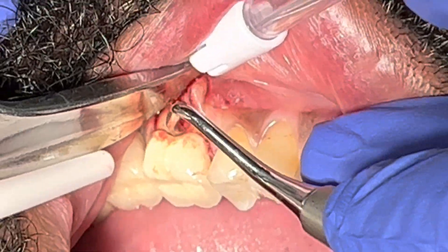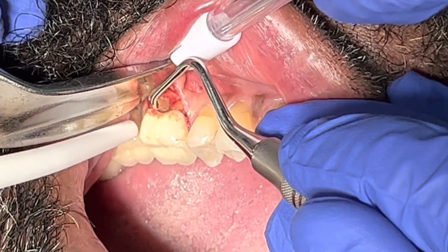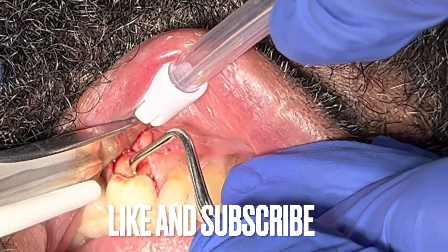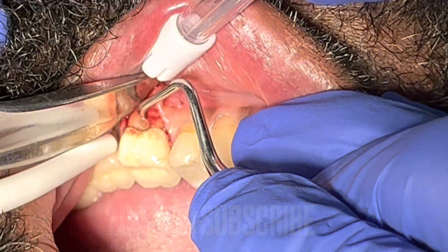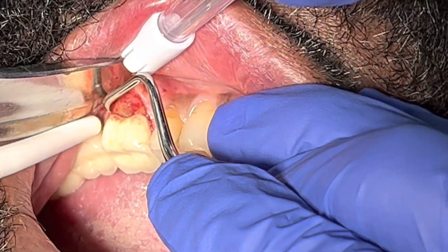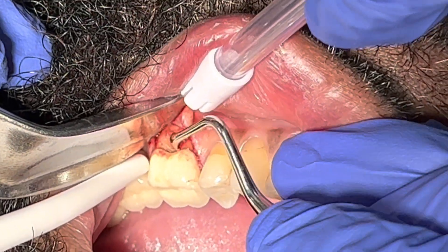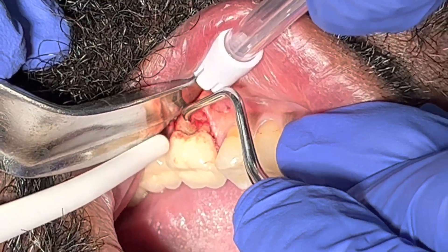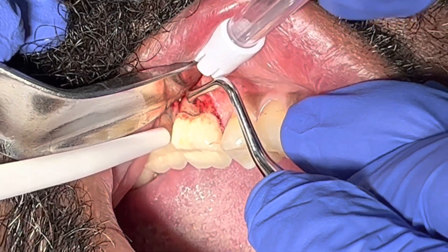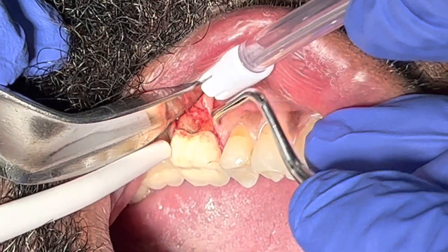I want you to understand that this procedure was an exploratory surgical approach — open, clean, and assess whether the tooth could be saved, saved with grafting, or removed if there was a vertical fracture. The only way to determine a vertical fracture is to open the flap and visibly see the crack. In this case, I did physically see the vertical fracture on the mesial root of tooth number 19, so it had to be removed.